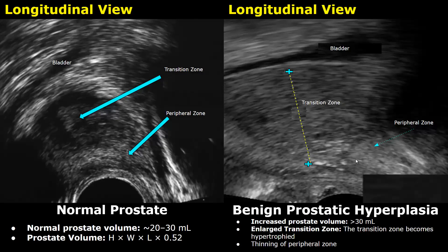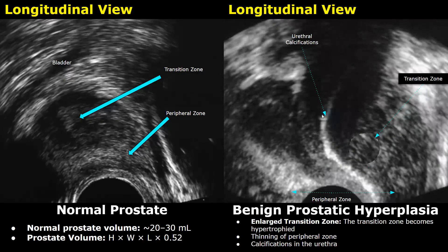In this case of BPH, urethral calcifications are present. This hyperechoic linear structure is the calcified urethra. You can also see enlargement of the transition zone — this hypoechoic heterogeneous area is the transition zone.